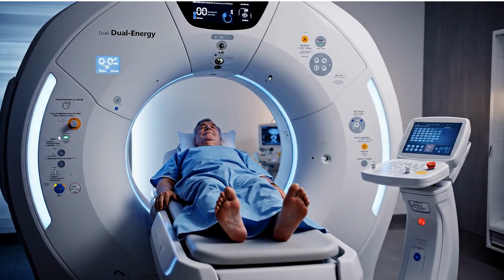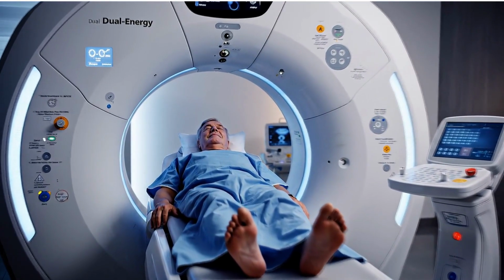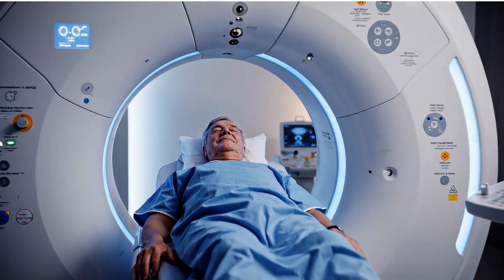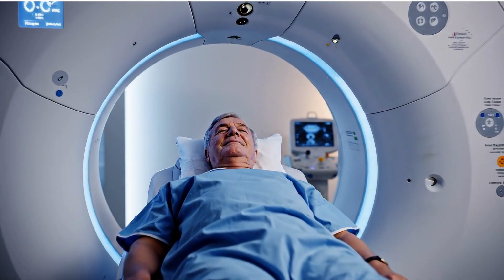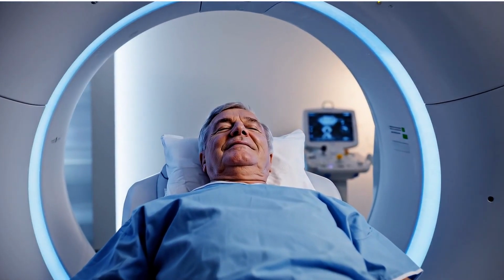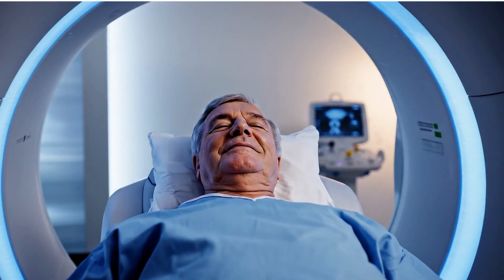From a patient standpoint, undergoing a dual energy CT scan feels no different than a standard CT scan. You lie comfortably on the table, slide smoothly through the scanner bore, and the scan finishes in just a few seconds. No special recovery time is needed, and advanced scanner technology ensures that acquiring two energy levels simultaneously keeps your overall radiation dose comparable to traditional single energy scans.